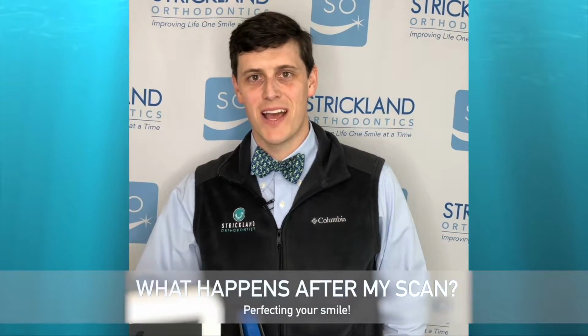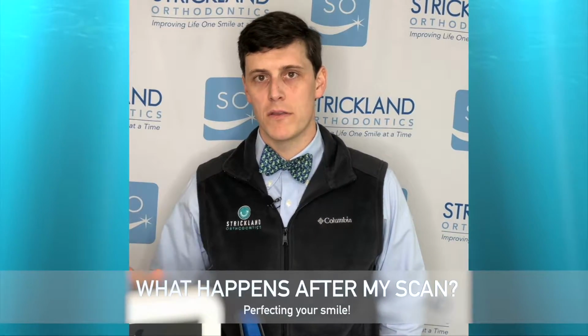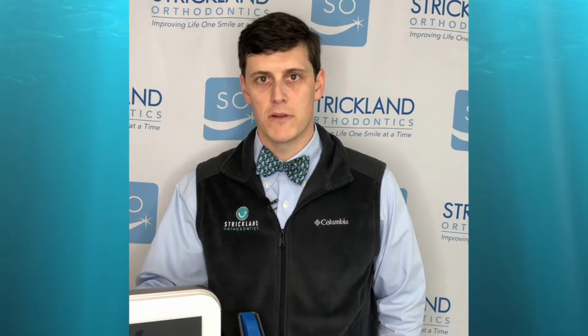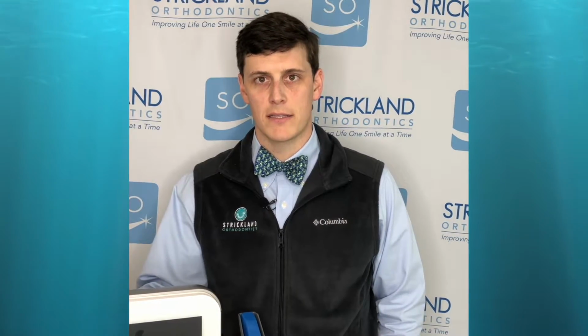Are you curious to see what happens to your Invisalign scan after you come in for your initial appointment? If you are, stay tuned and I'll walk you through what we do on our back end to make sure that we fully customize your treatment. And then also I'll go through a couple of key points of why it is so important to make sure you know who exactly is doing your Invisalign treatment for you.